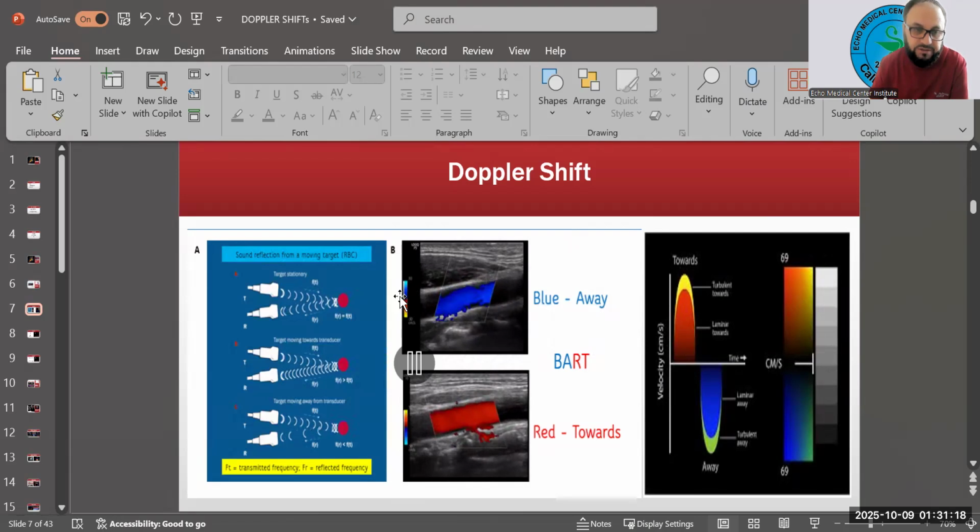Look at here. This color bar is for this artery. So the shift, they just inverted it. Otherwise, this is a positive Doppler shift. It's just that the color is blue because somebody inverted that button. And also look at the angulation. Here, the angulation for this vessel is the box is steered to the left. And here, the box is steered to the right.